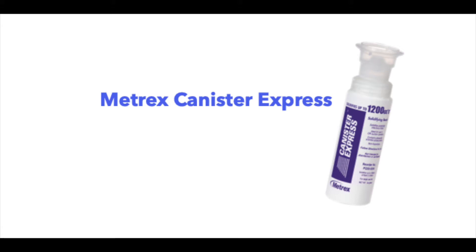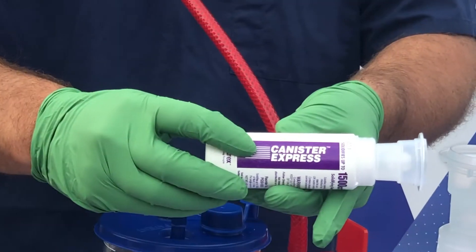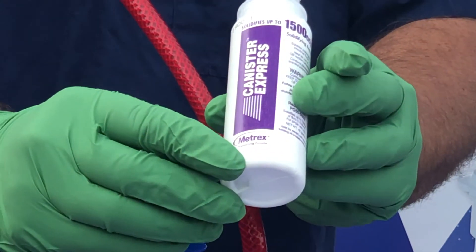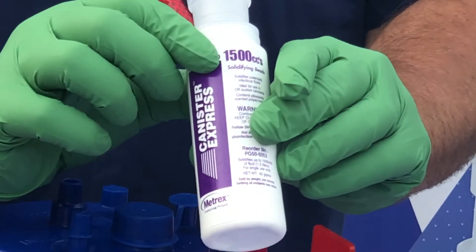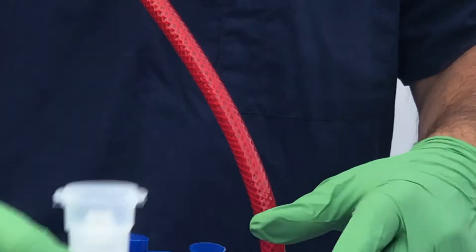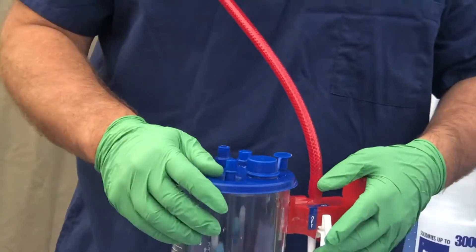Canister Express is a liquid medical waste solidification product. It was engineered to solidify liquid medical waste in suction canisters from the bottom up. What we're demoing in this video is the 1500cc size, which can solidify up to 1500cc of liquid medical waste.